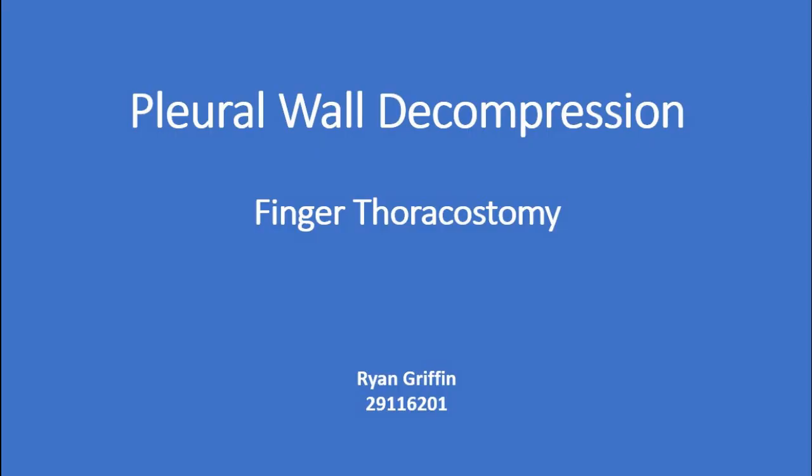Within this video, I will be discussing tension pneumothorax, pleural wall decompression, and I will demonstrate a finger thoracostomy.